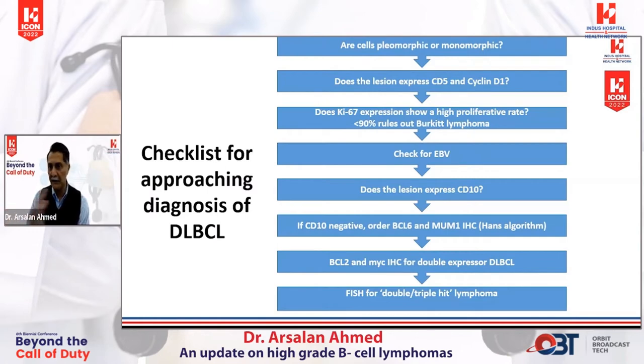If all of them are negative, or EBV is negative, CD5 is negative, and Ki-67 is less than 90%, the next thing is I want to call it diffuse large B-cell lymphoma. The next step would be, is it CD10 positive? If it's CD10 positive, then I'll call it diffuse large B-cell lymphoma, germinal center type. If it's CD10 negative, I'll have to order BCL6 and MUM1. And I'm going to discuss this in the Hans algorithm.